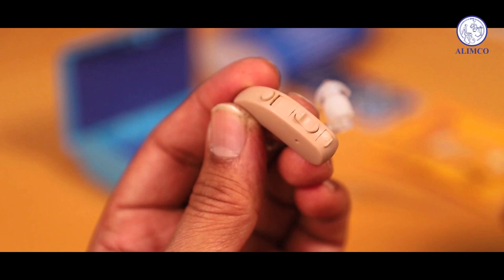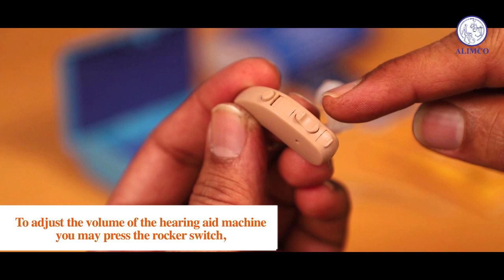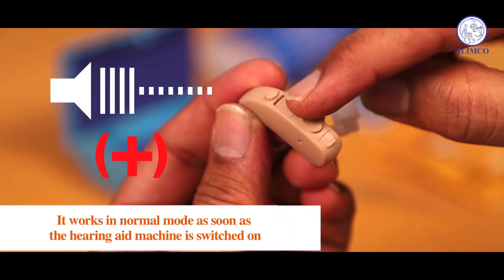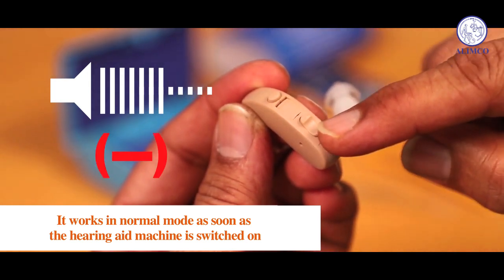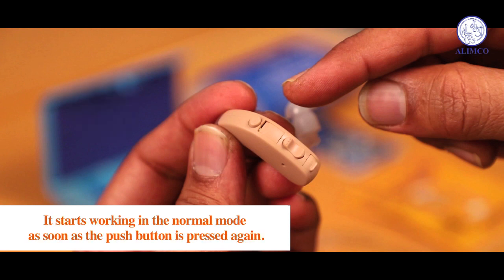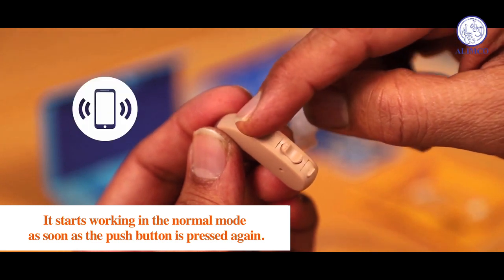Let's guide you about the rocker switch and the push button of the machine. To adjust the volume of the hearing aid machine, press the rocker switch. It works in normal mode as soon as the hearing aid machine is switched on. To talk over the mobile phone, the push button has to be pushed once. It returns to normal mode as soon as the push button is pressed again.